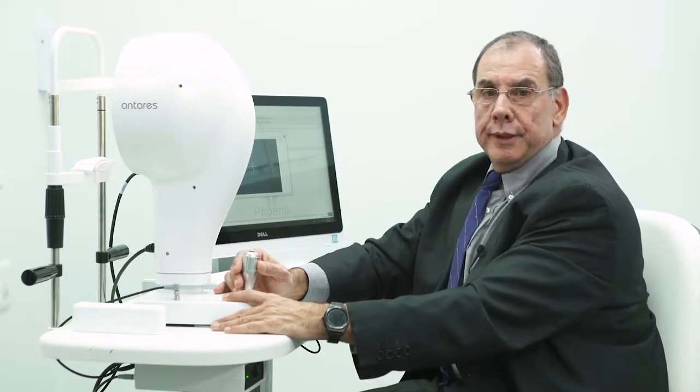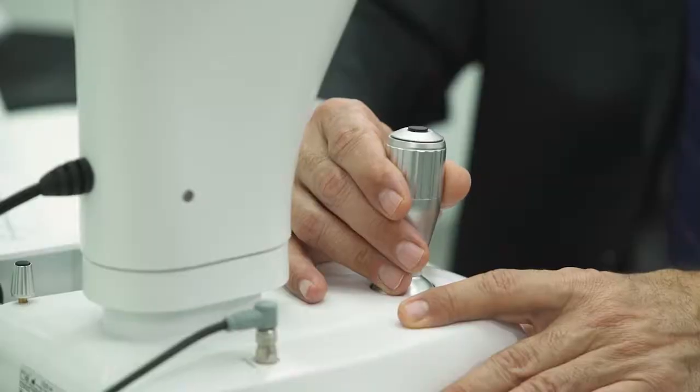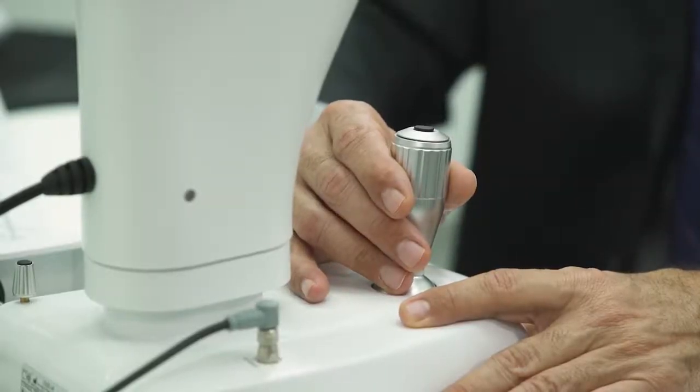We're going to get a reflex off the cornea, a little dot, and we're going to have a centering cross. Our task will be to align these two together, so that the dot is in the center of the cross. And then we're going to bring the topographer slightly back out of focus.